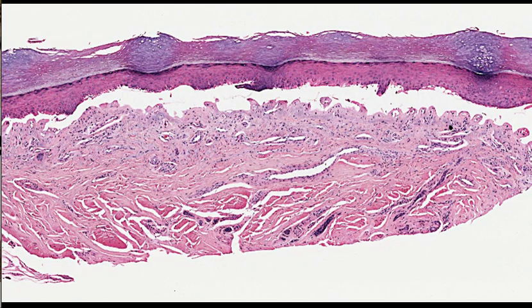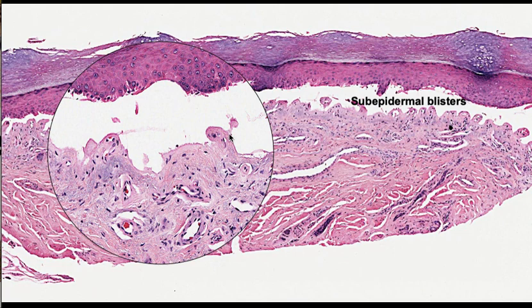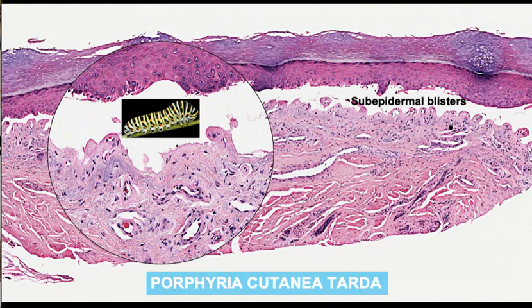The next example, we have subepidermal bullae formation. It looks like we don't have any cell type, so this is pauci-cellular. If we go on high power, we see the dermal papillae are preserved. And if you look here, you will see this caterpillar sign, where the cells make an eosinophilic, chain-like or sequence-like pattern. So this is porphyria cutanea tarda. We said if you do PAS staining, those vessels will be highlighted by thick hyaline pink material of immunoglobulin that is positive for PAS.